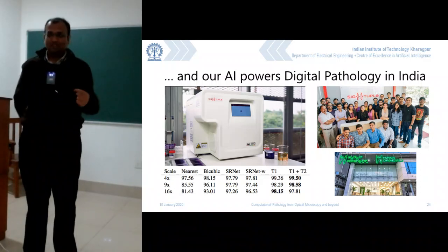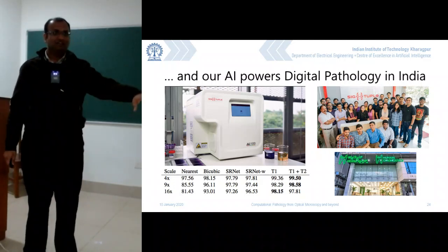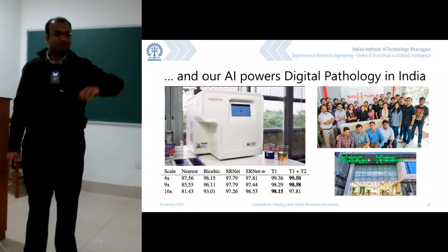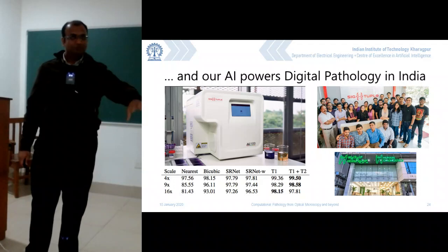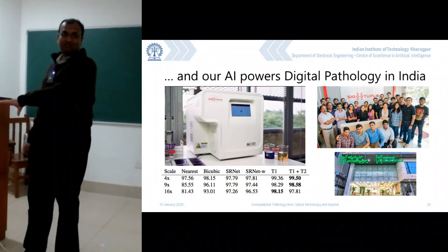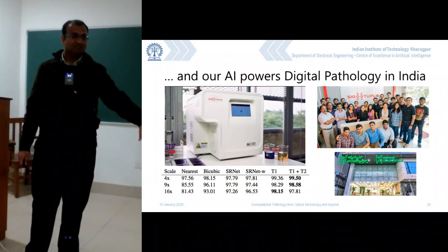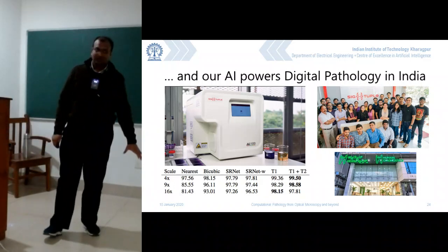And this was not that paper type blood test which Professor Suman Chakravarti was doing. These are actual microscopic level tests which are not biochemistry. These are where you will have to actually count and look at cells and make an inference out of it, which still is a visual process. You cannot have any other way of doing it. And this breaks things from a 3-day process to just a couple of minutes on the process itself. And that's a change which it's bringing on.